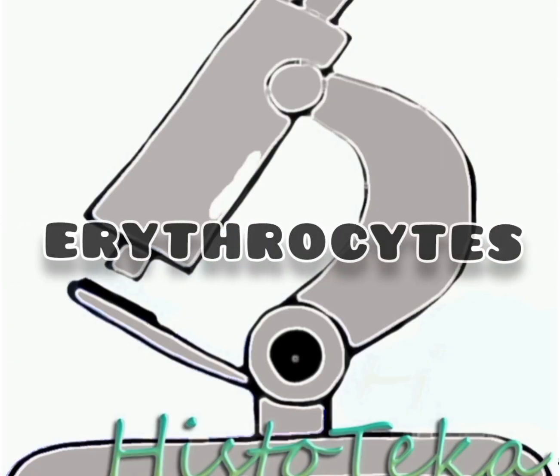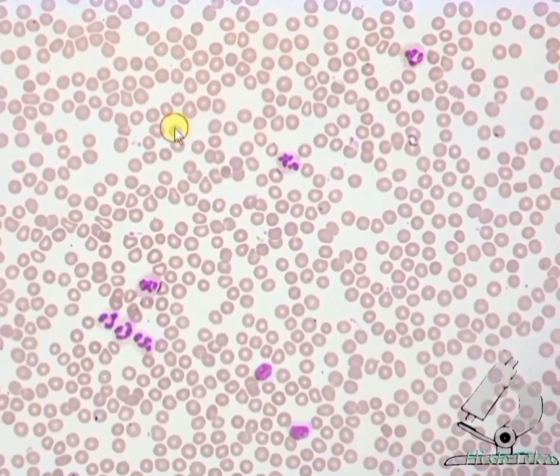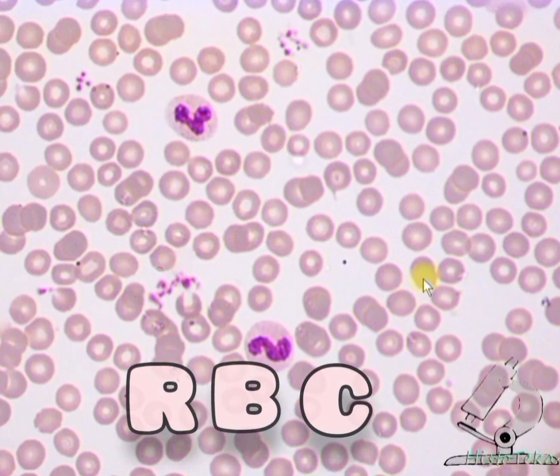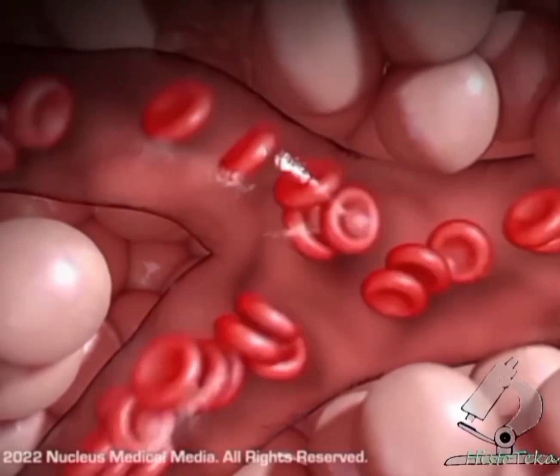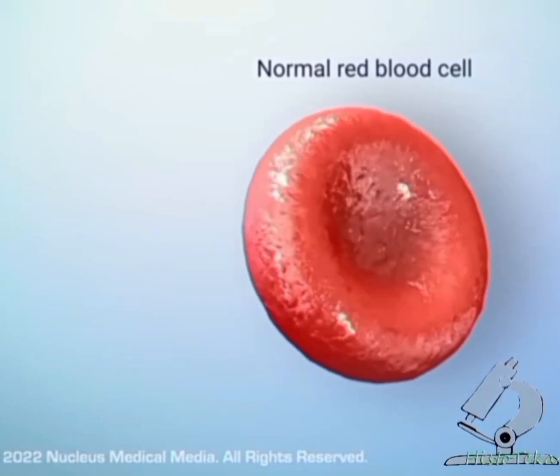So, a blood smear, low magnification. The main part of the formed blood elements is represented by erythrocytes, which is clearly visible on the preparation. These are all erythrocytes or red blood cells. The diameter of red blood cells is 6.2 to 8.2 micrometers. They are devoid of nuclei as well as almost all other organelles, rounded in shape and lighter in the center, because they have the shape of a biconcave disc and the center is their thinnest point.